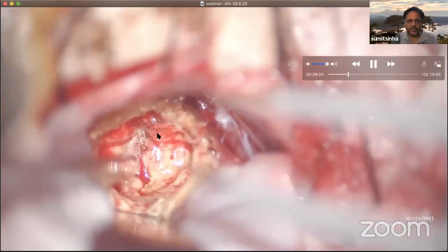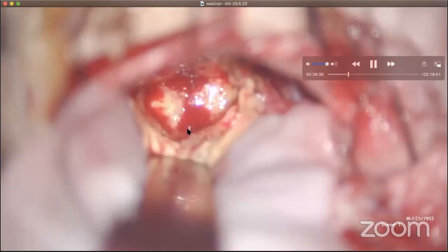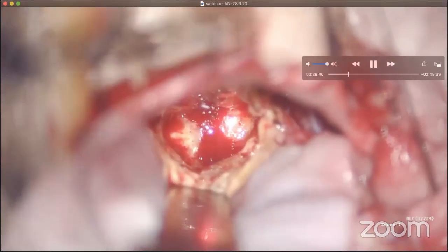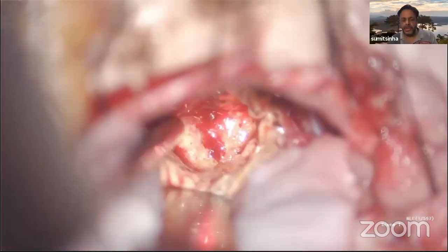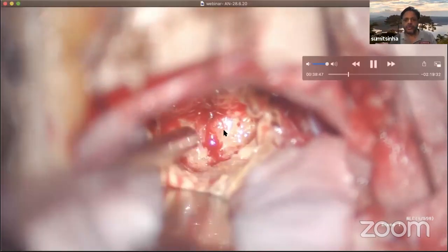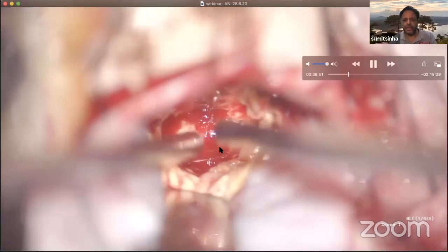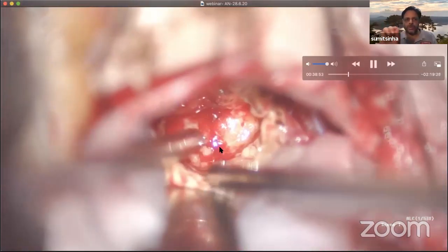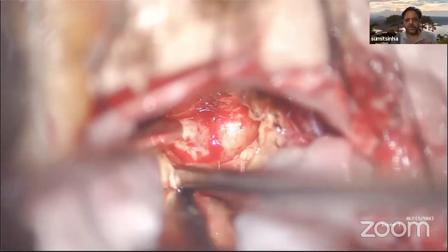Some bleeding, I mean, now the problems happen in managing the bleeding if it happens to be a really vascular tumor. So there are some tricks which I want to tell for managing vascular tumors. Now, suppose this tumor is not so vascular, meaning the bleeding is very well controlled by applying one or two bipolar and that's it. But sometimes it bleeds like hell, terrible.